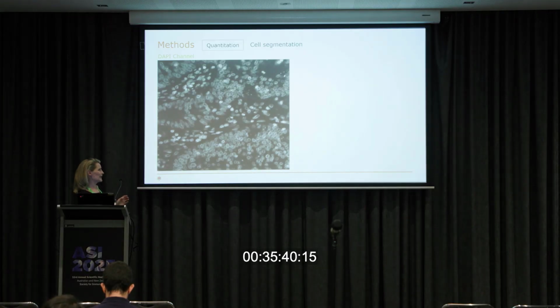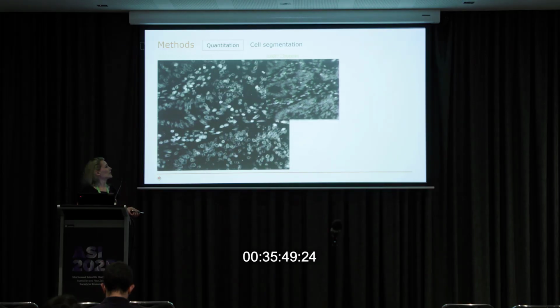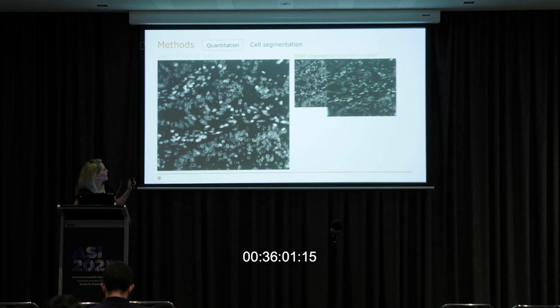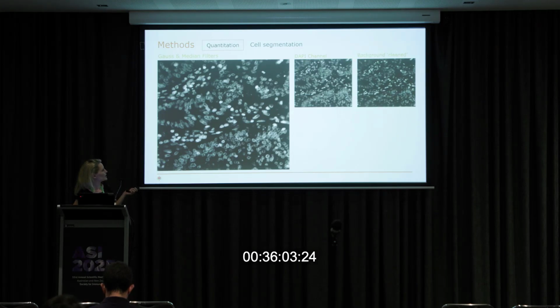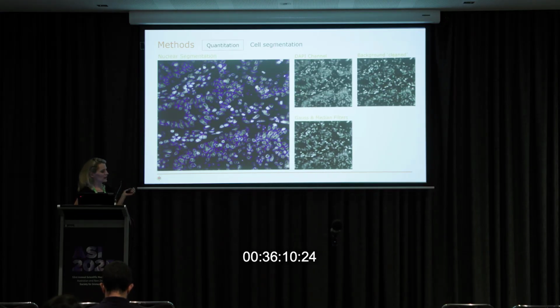So this DAPI isn't particularly pretty. We see a little bit of spillover into here, a little bit of autofluorescence, but we can actually do some corrections and remove some of that background, it's almost a compensation for crosstalk. This is showing us the original segmentation that we would do for the nuclei. Bianca showed us that if we create some filters on the DAPI staining, we can then get an improvement in our nuclear segmentation. I will point out our samples are pretty tricky.